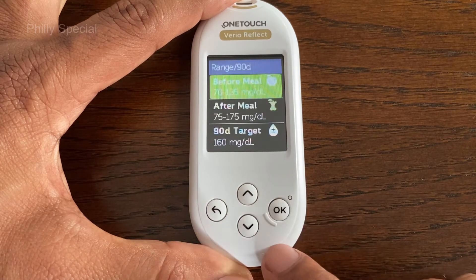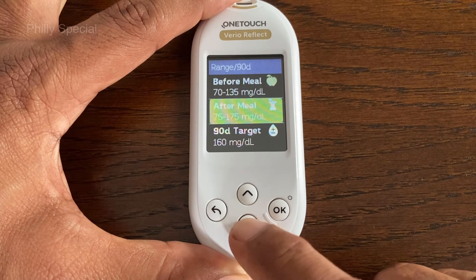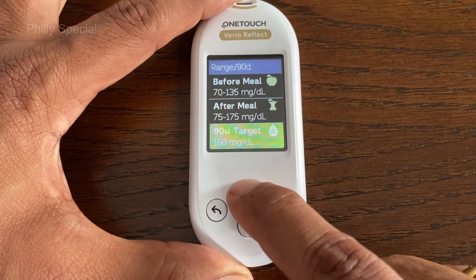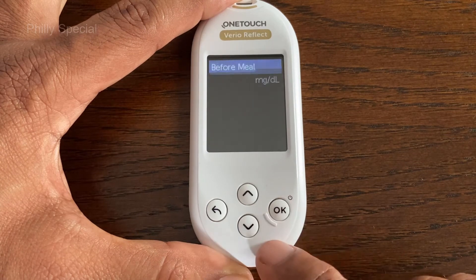Scroll down to highlight Range/90D and press OK. Your current meter settings are displayed, showing Before Meal, After Meal, and 90-Day Target. Highlight the range setting to be adjusted and press OK.